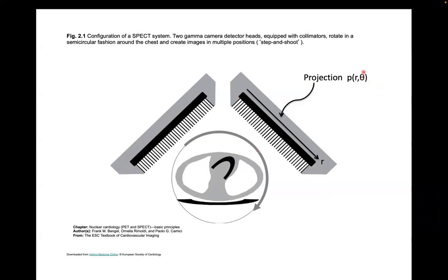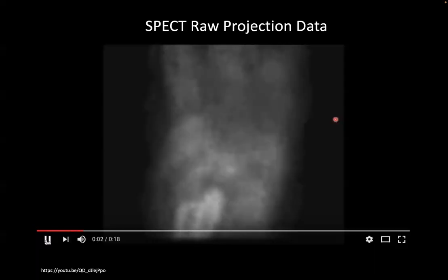And so we're going to click through a set of thetas. We'll take this whole system and click it, say, by 1 degree, theta changes, and then we get a new P(R, theta) function. So mathematically, that's how you want to store your data.